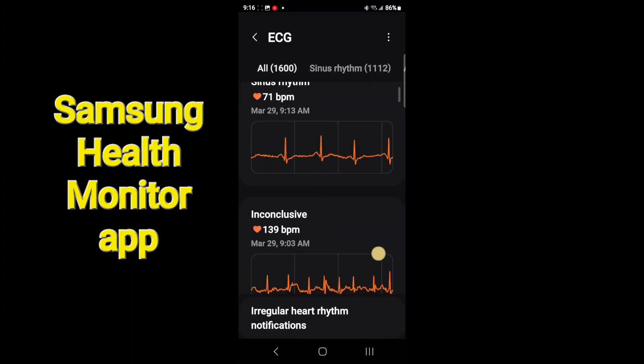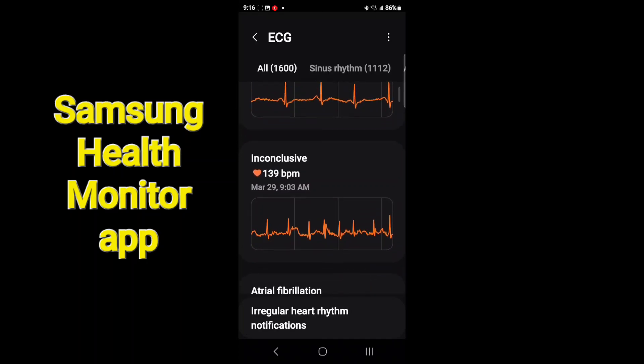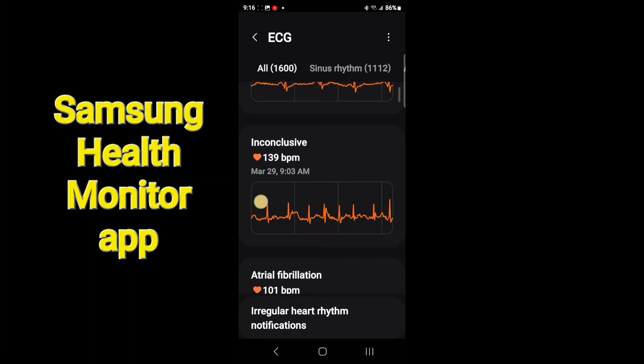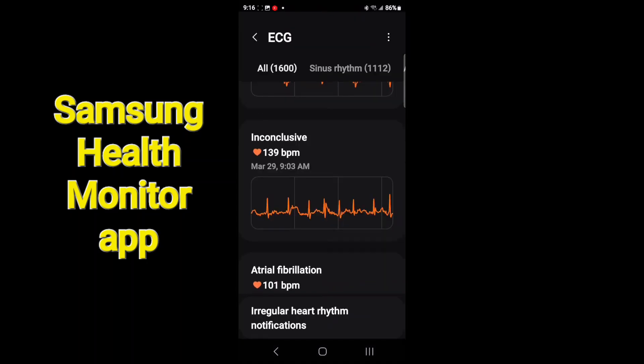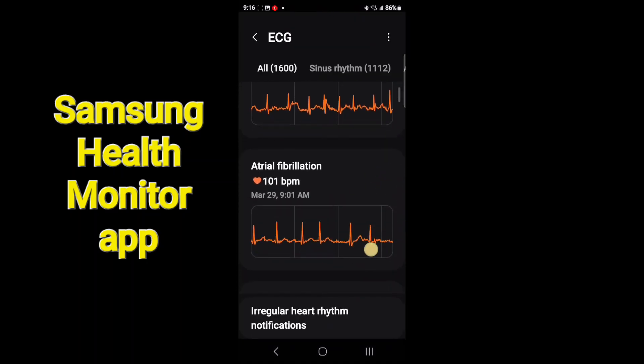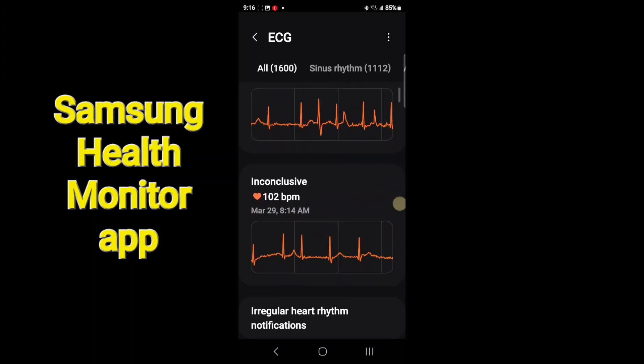If I go to View History, I can sort by different things. Sometimes you get an 'inconclusive' result — it doesn't read properly or can't classify it. If the heart rate is too fast or too slow, it'll say inconclusive. If it's a bad reading, it'll tell you it's a bad reading.